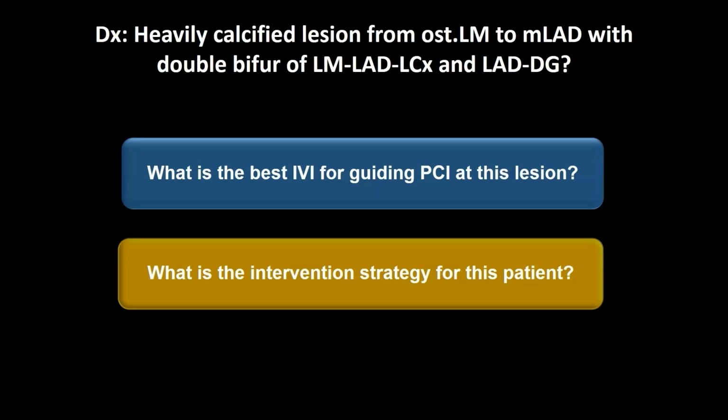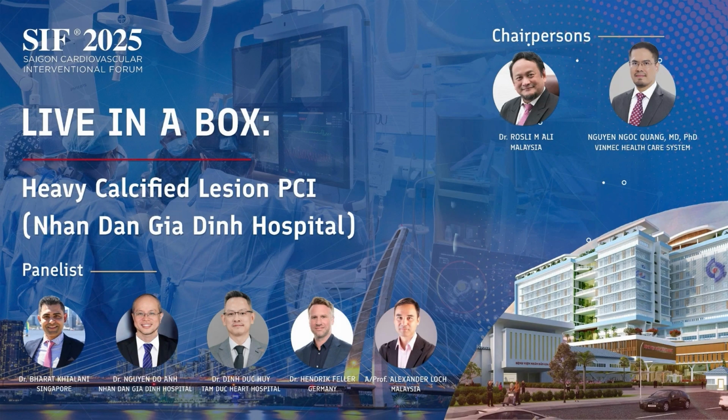The imaging, right? You don't touch the, okay. So we start again with Dr. P.